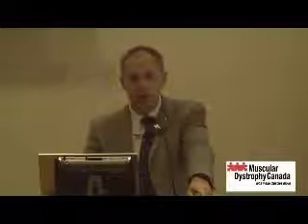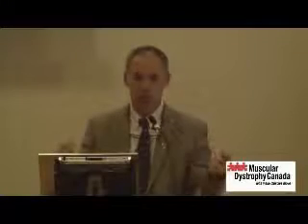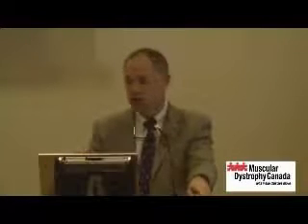So this is the cough assist device, which again may be necessary if peak cough flows remain inadequate. This is a device with a motor like a vacuum cleaner, to which you can apply positive pressure or negative pressure. The positive pressure increases lung volume, and you switch immediately from positive to negative, and the negative literally vacuums out the airway. So it mimics a cough, and you can get peak expired flows of 12 liters per second or greater.